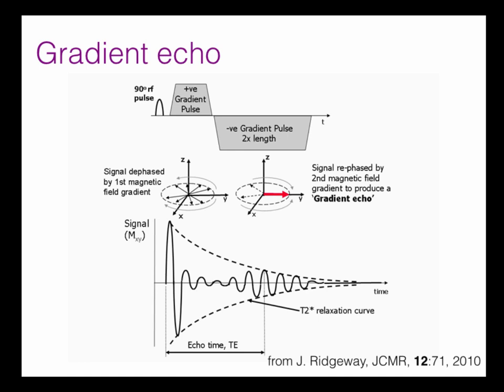And so what we can do is record the signal that we hear, because we get all the signals from this transverse plane. And we get a combination of low frequencies and high frequencies. When we look at those signals, we can use something called a Fourier transform to sort out the amount of each frequency present. And that'll tell you if there's more signal on the left or more signal on the right.